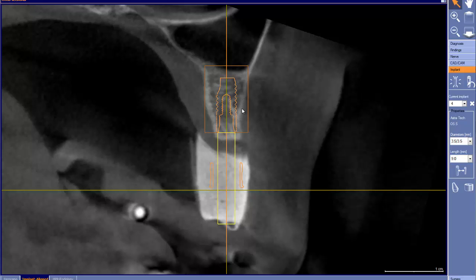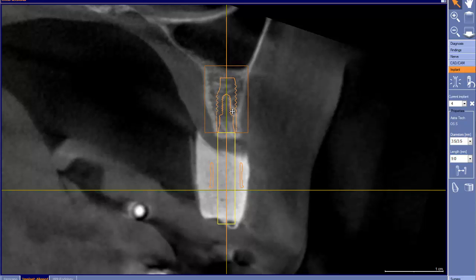How is our surgical technique going to affect this bone right here? If we flap, does it affect one way? If we don't flap, does it affect one way? And these are all the questions that we have to ask. How big of a drill are we going to use? Is our implant going to condense on this area? So these are the things that we have to ask ourselves and understand when we make this plan.